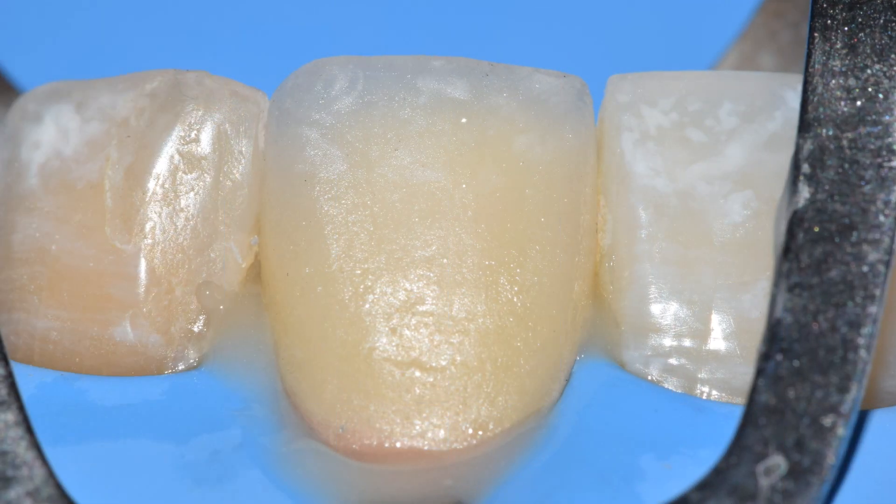This core material is a dual cure core material. It is necessary that I use a dual cure core material because before I am removing the crown, I want the entire core material to turn hard. Once the crown has been fitted, I am waiting 3 to 4 minutes for the chemical curing to happen. As an adjunct, I am using light cure also. But in areas inside the root canal where light cannot reach, it is necessary to use a dual cure material so that the material hardens itself chemically.